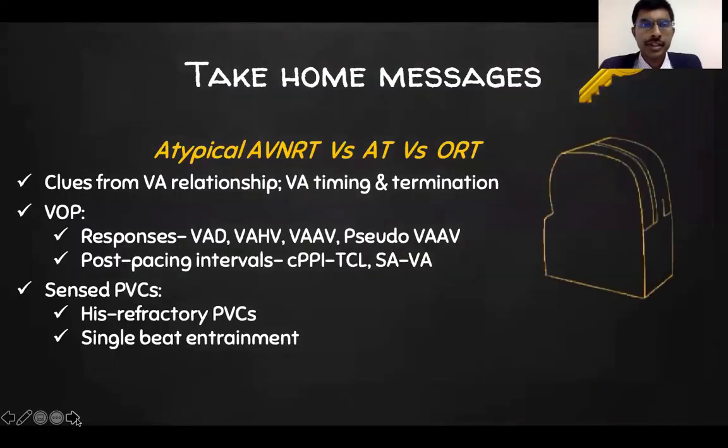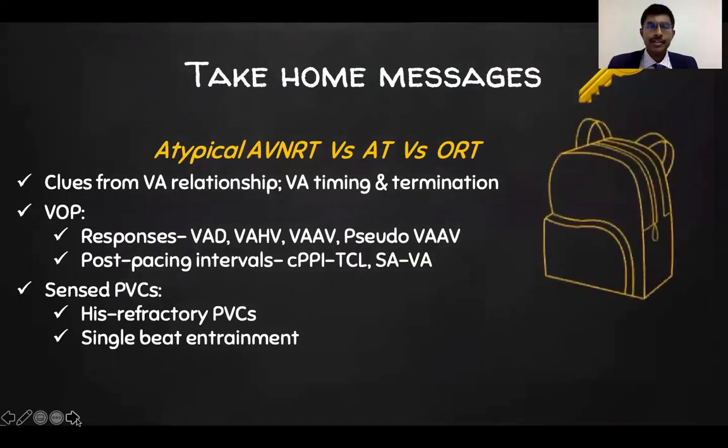Thereby, my dear friends and colleagues, I would like to conclude by reiterating that important clues can be derived from studying the VA relationships, timing, and the mode of termination. Study the principles behind these responses that you see with ventricular overdrive pacing and the post-pacing intervals. Sensed PVC maneuvers are very helpful, and you can always try them before even the ventricular overdrive pacing.